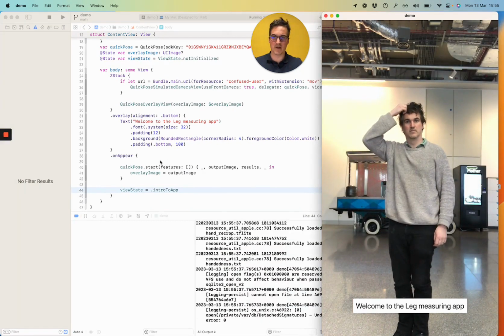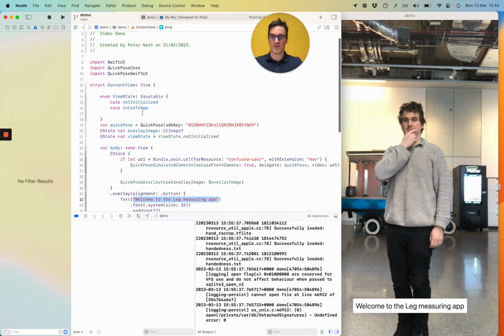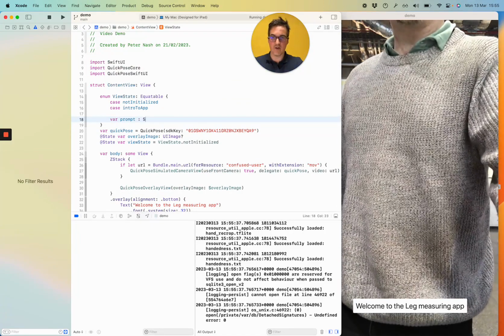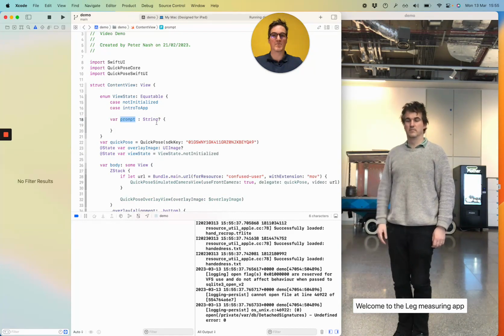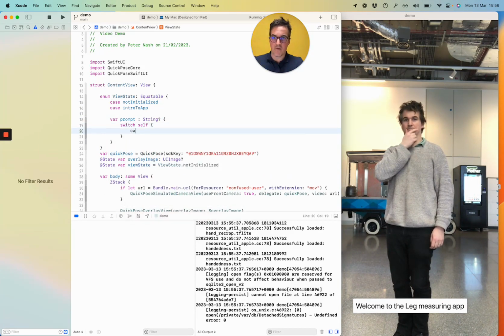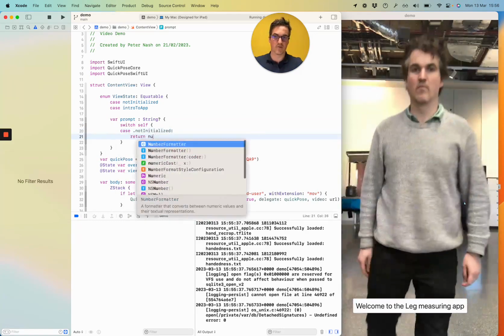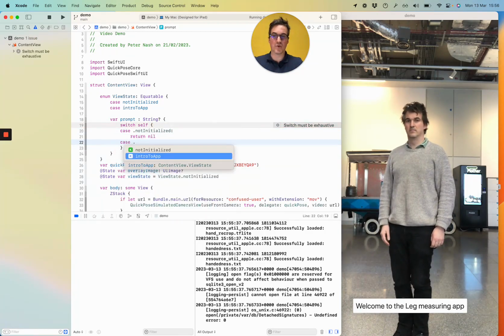Cool. Well, it looks very similar to how it did before. What we probably want is the text here to be dependent on the state. So I'm going to create a computed value here, and it's going to be an optional value, and it basically says some of these states has a prompt. I'm going to use a good old switch. So not initialized returns nothing because we don't really want a prompt when it's not initialized. But I do want intro to app.